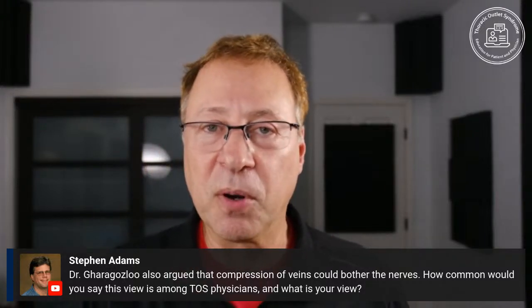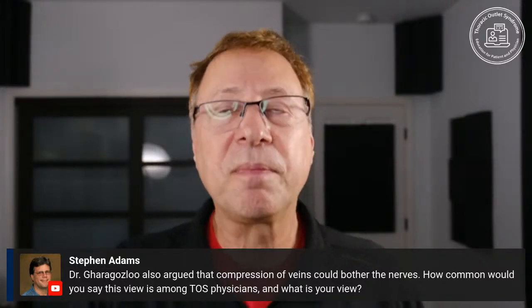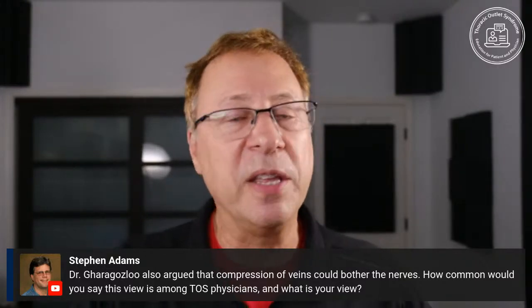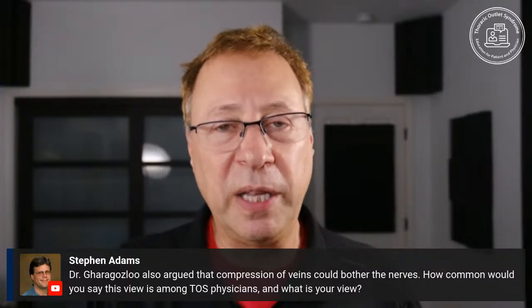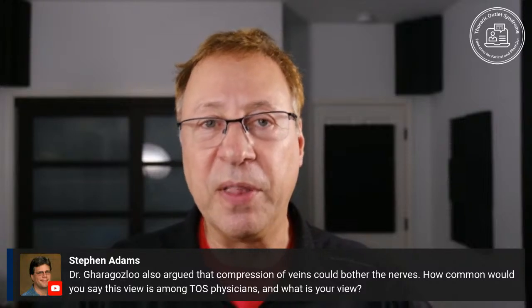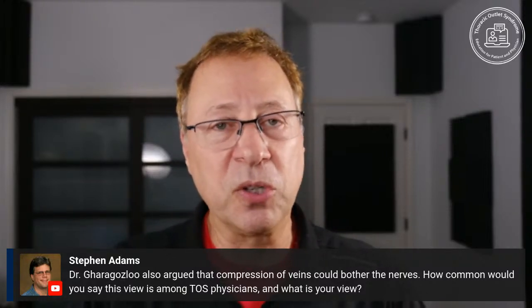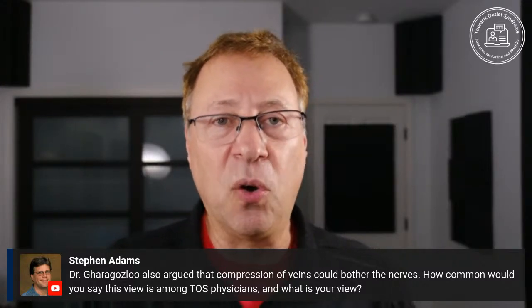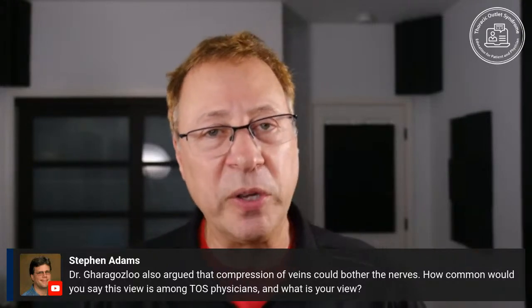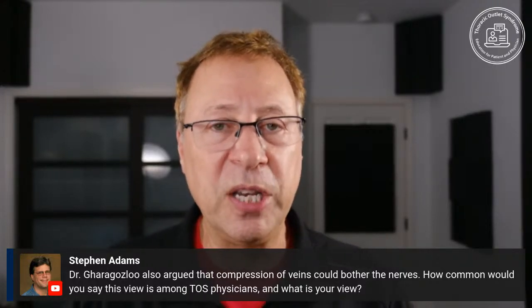Now, we don't know the numbers. We haven't done research on this to prove it yet. It will be challenging, but a lot of docs in the field just see the direct compression effects. My opinion, which is supported by some of the literature, is that there is evidence out there that venous compression by itself can either cause or contribute to those other findings of compression or stretching. And therefore, we need to always be looking at the veins. That's what we do with our MRI. No matter what we see on the brachial plexus, we always describe the veins. And those need to be treated if there's the clinical finding of TOS.